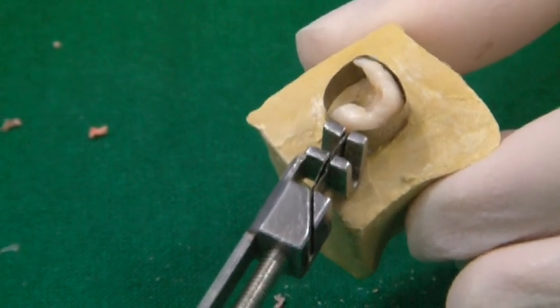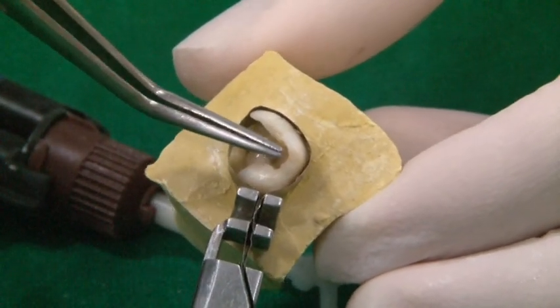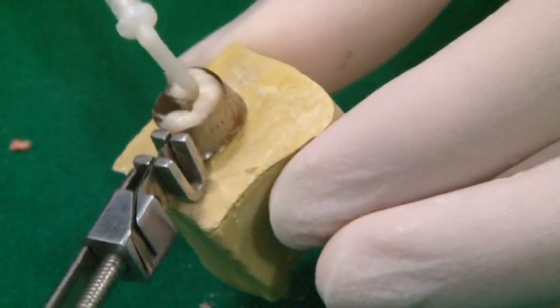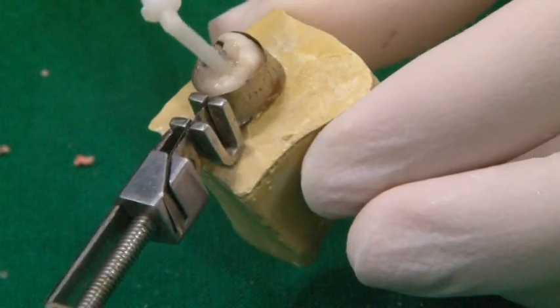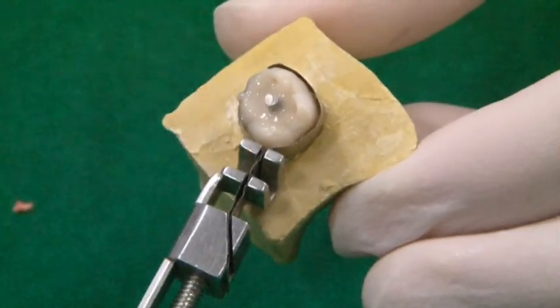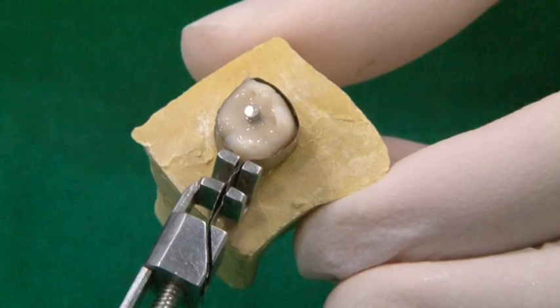Place a Tofflemire matrix band and retainer covering the margins of the tooth completely. Start syringing Luxa core around the post onto the tooth. Care should be taken to not let the intraoral tip of the syringe become embedded in the material as it flows out, in order to avoid voids. The core buildup is now cured for 20 seconds, the matrix band is removed and the tooth is finished.